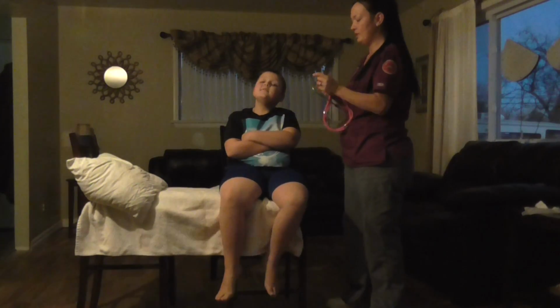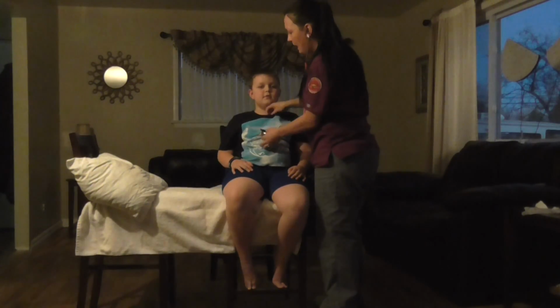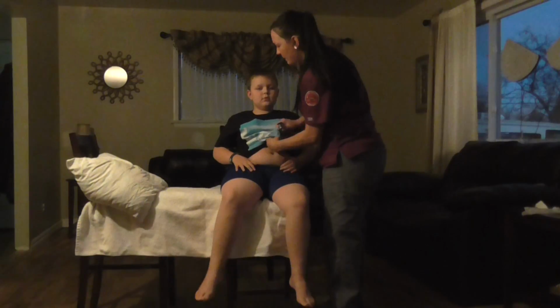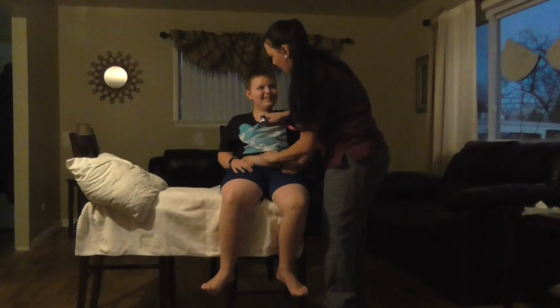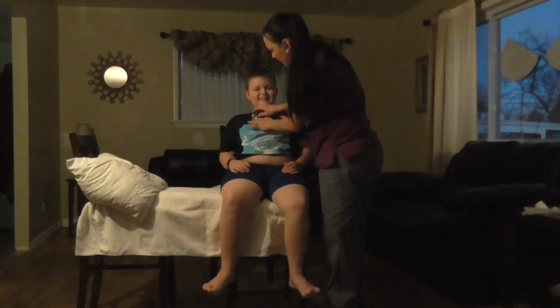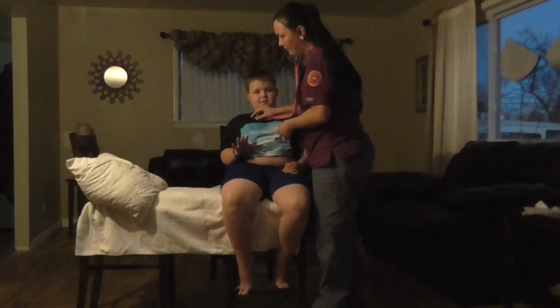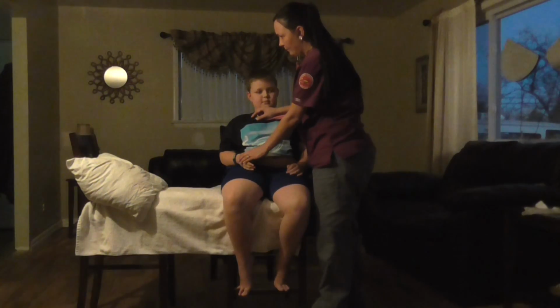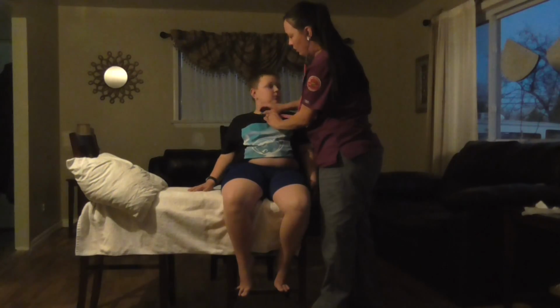Then I would go into auscultating with the diaphragm of my stethoscope. First, I would check on the right sternal border, second intercostal space. I would know my intercostal spaces by feeling in between. One, two, and here's where I would check the aortic valve. Okay, sounds normal. Rate is normal and strong.